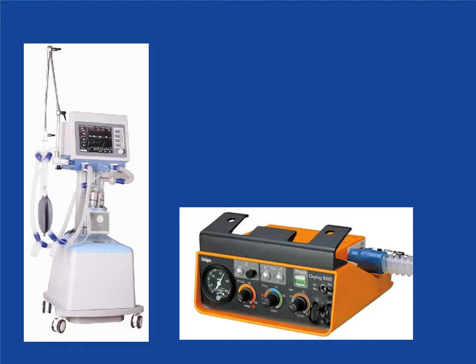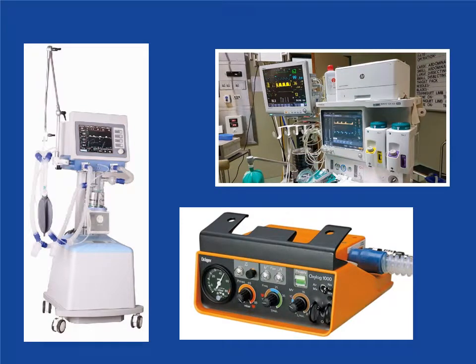Now, this is a more advanced ventilator that you may see in an intensive care unit. Or if you work in anesthetics, then you will probably have seen something like this. A ventilator incorporated into an anesthetic care station. They look very different, but they all actually do pretty much the same things.